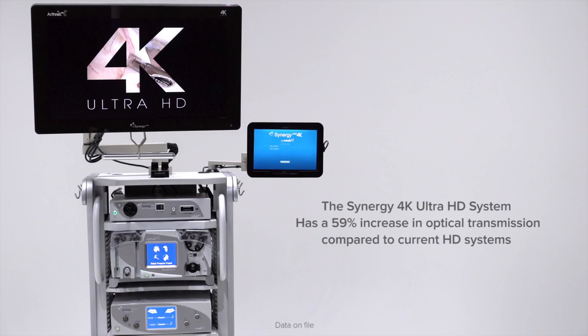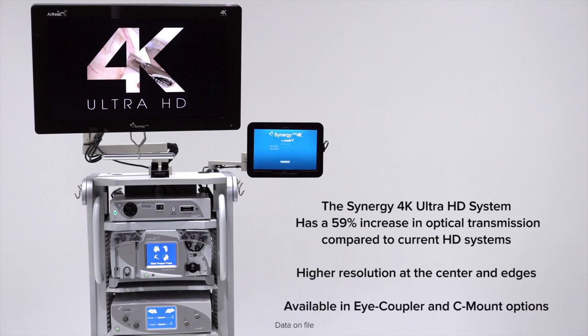Hi, my name is Chris Adams and I had the unique opportunity to use the world's first 4K arthroscope. The 4K arthroscope has a 59% increase in optical transmission compared to the HD scope. It has higher resolution at the center and edges and is available in iCoupler and C-mount options.